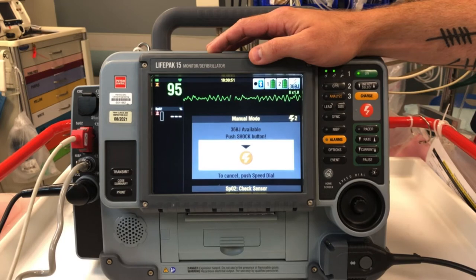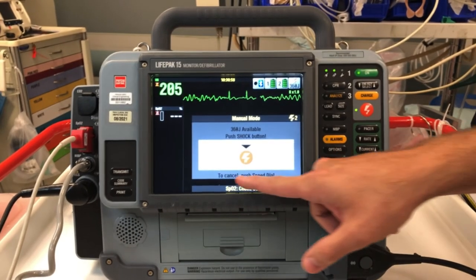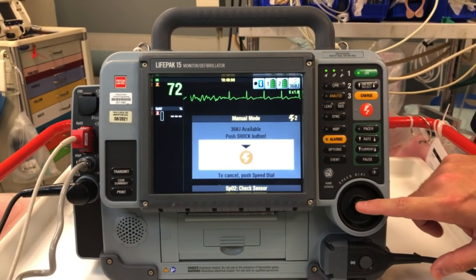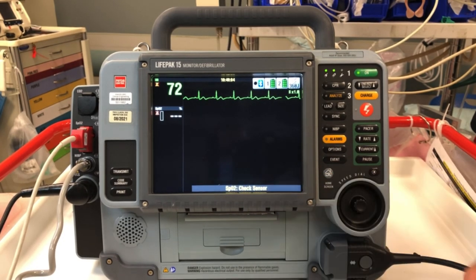Now you're going to do your pulse check. If your patient has a non-shockable rhythm, in order to not shock, if you notice down here, it says to cancel, push the speed dial, push the button, and it will dump your shock and say disarming on the bottom of the screen.